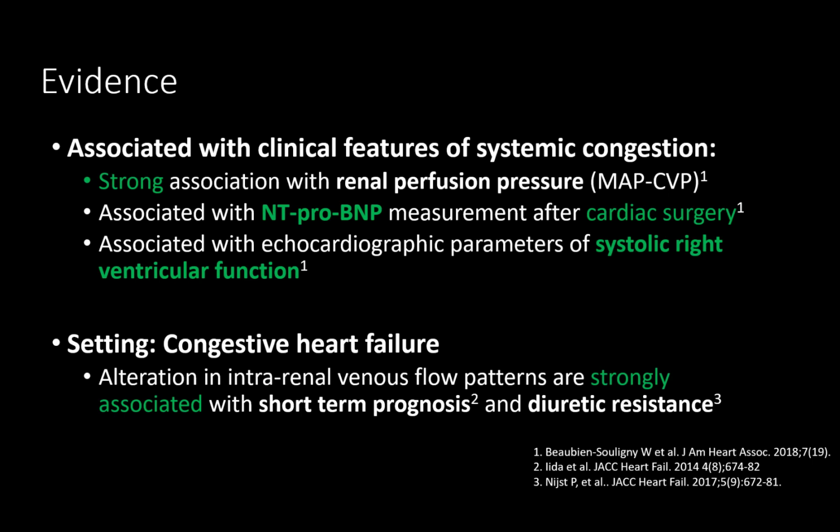In terms of evidence, intrarenal Doppler venous congestion is associated with clinical features of systemic congestion. There is a strong association with renal perfusion pressure. It is associated with NT-proBNP measurement after cardiac surgery. It is also associated with echocardiographic parameters of systolic right ventricular function. In the setting of congestive heart failure, alterations in intrarenal venous flow patterns are strongly associated with short-term prognosis and diuretic resistance.